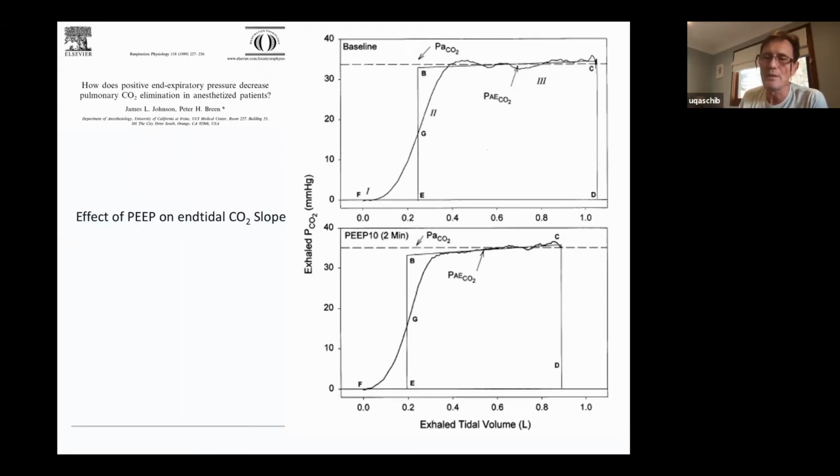Just to rejuggle our memory just towards the end, what I've described is nothing new. We all know that because we know that the CO2 signal tells us a lot about ventilation maldistribution due to diffusion dependent processes. We know that the slope, if it gets steeper, then we have more maldistribution of the acinar contribution to the ventilation distribution.